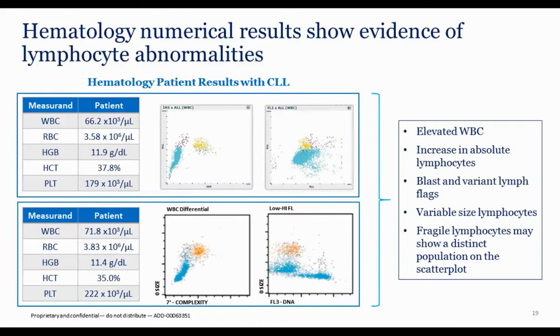Now, these histograms, again, will vary depending on the analyzer that's being used in the laboratory, but we would certainly see our cell clusters with our lymphocyte population, a monocyte population, and a granulocyte population. But what you'll notice is that since we have an increase in lymphocytes in this particular cluster, you can see that it's quite long.